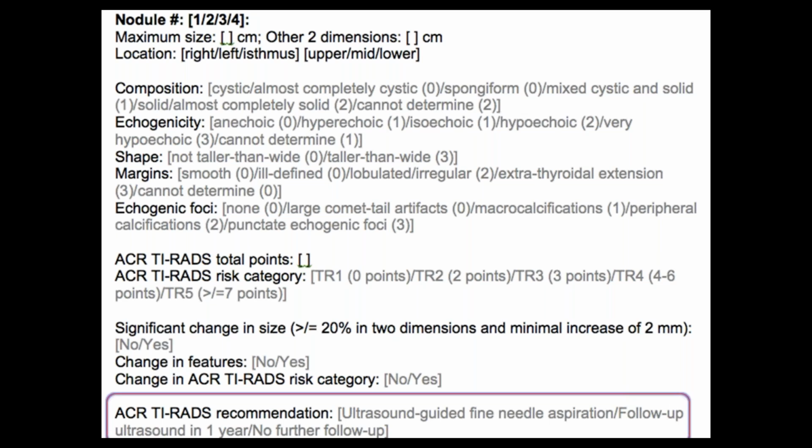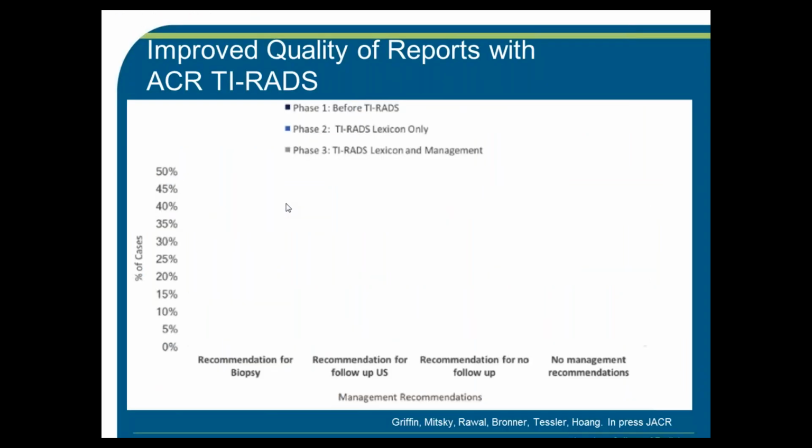Can't I just free text what I'm seeing and then refer to the chart? Well, let me show you a study that clearly shows that a structured reporting template like this with a checklist is very valuable. This is a study that is now in press in JACR.